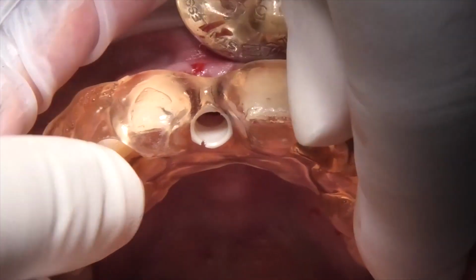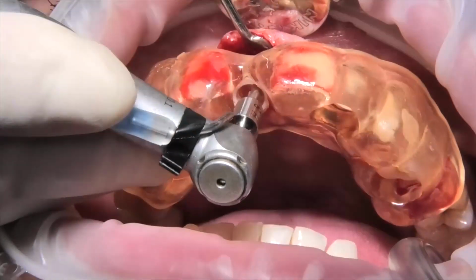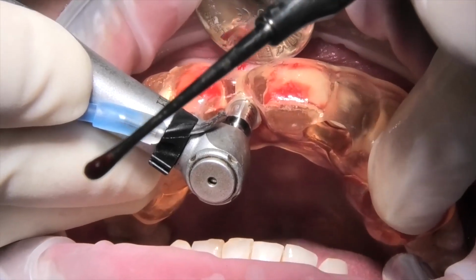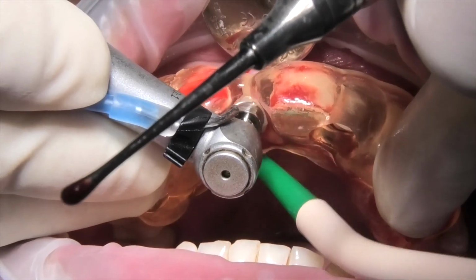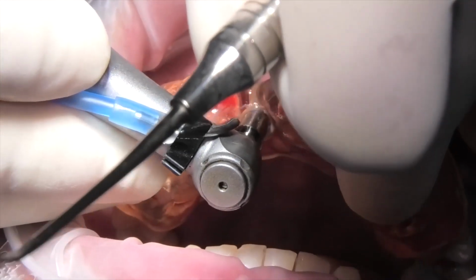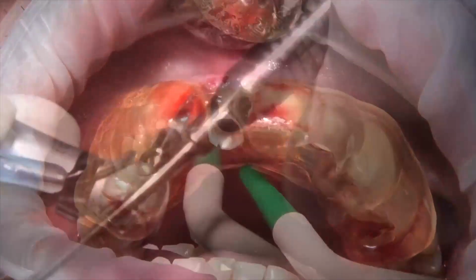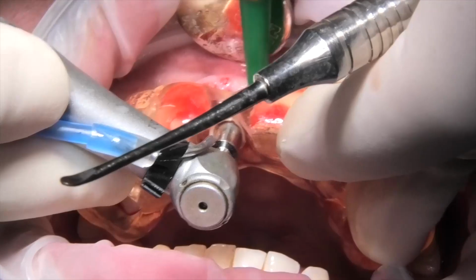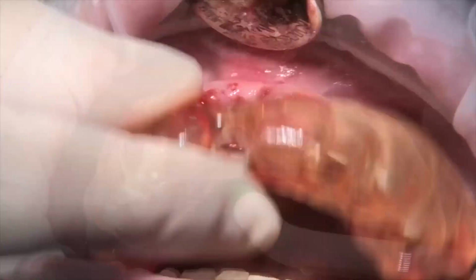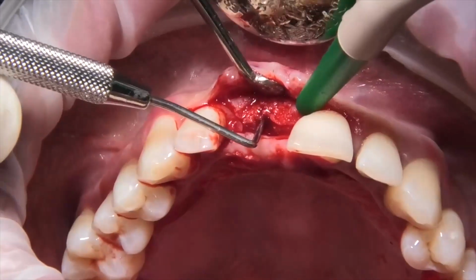And so next I try the tooth-supported surgical guide, checking that it fits perfectly with precision, and being careful to let the vestibular flap stay outside the guide. So we start the passage of the drills following the surgical protocol of the chosen implant system. The drills will go in sequence from the 2.2 millimeter diameter up to the 3 millimeter drill with a length of 11.5 millimeter to prepare the socket for the chosen implant.